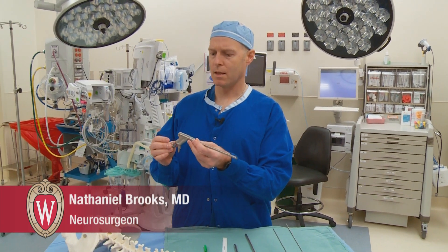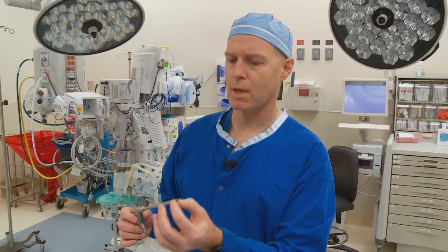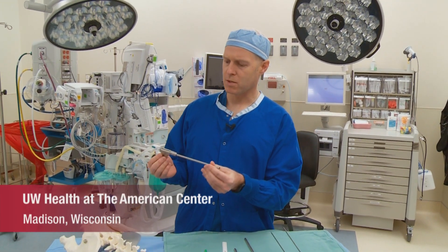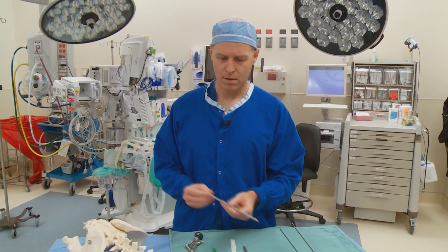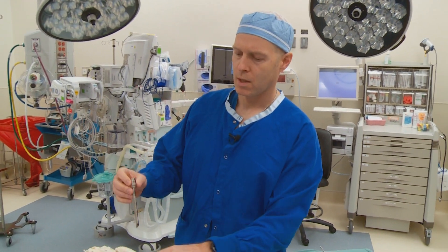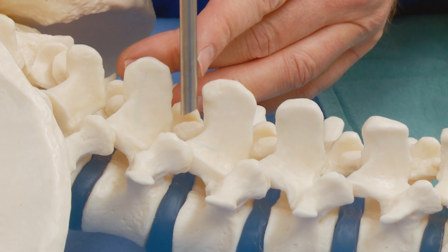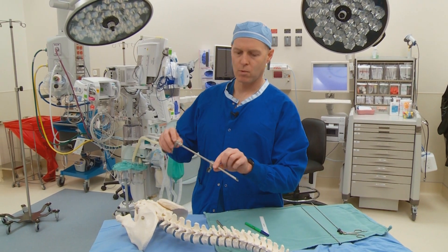This is the endoscope, and this is what's used to both visualize — there's a camera on the end — as well as to manipulate or remove tissue. This will actually work its way down to the spine. We use a series of small tissue dilators, you can see how small it is compared to just a marking pen, and then this little working port. We can work in the spine in various areas, and the working channel will be this little tube here, and the endoscope will work its way down it.